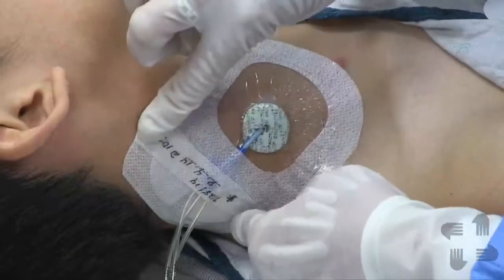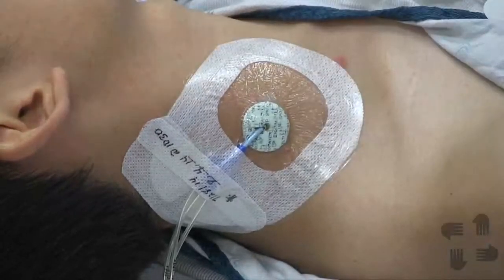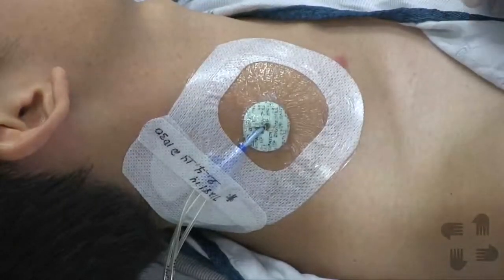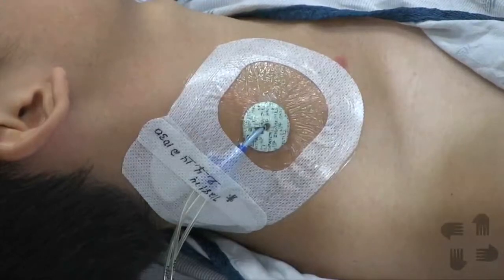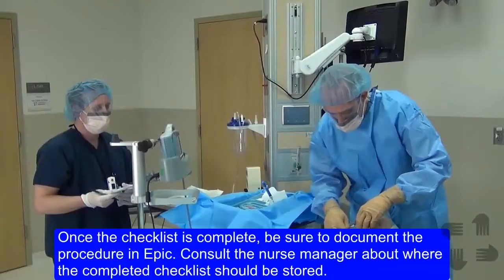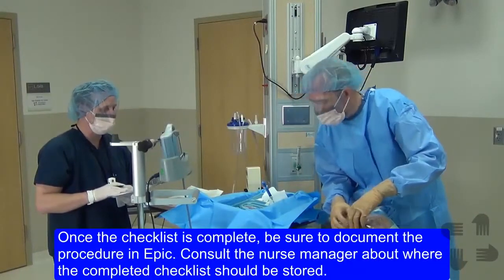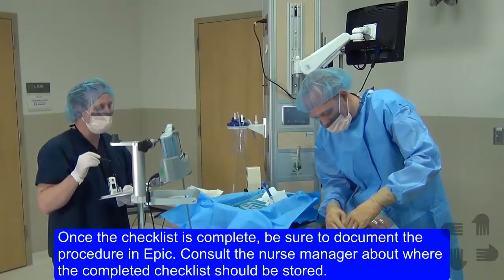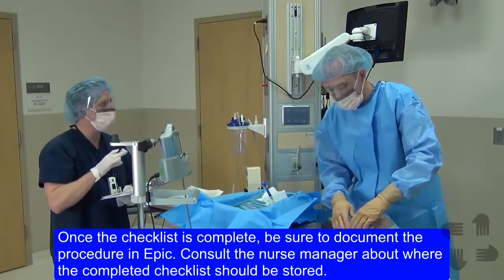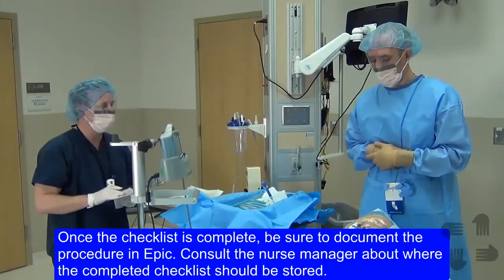Now that we've dressed the line, it is time to enter the chest x-ray to check for placement and enter the procedural note in the procedural note writer. That looks perfect. Our checklist is now complete, but let's make sure that we document in Epic. So you document the placement, and I will actually put in a line in Epic there.